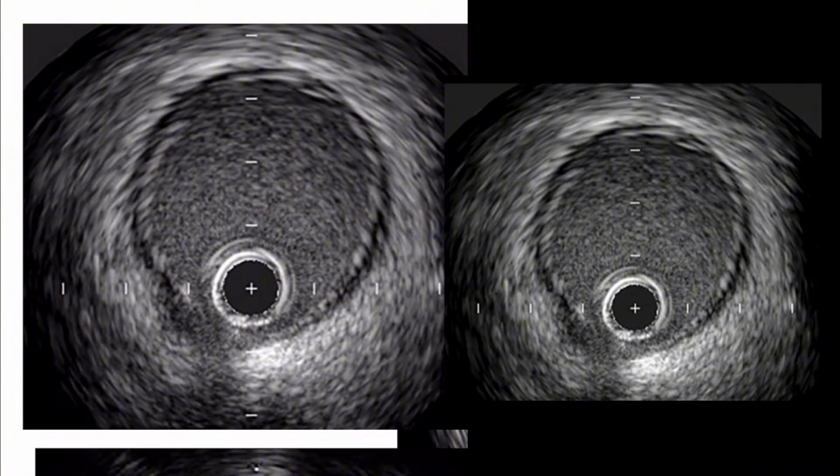Do you see the next color change where it goes to a brighter white and a different texture? It goes from the texture you're seeing here to this one. That actually looks like tissue, because it is tissue, and it's a little brighter white. So that is the start of the intima. All of this is the intima. You're not going to see everything in one frame all the time, which is why you toggle between frames. It's a little blurry here, a little blurrier here, and that's okay.